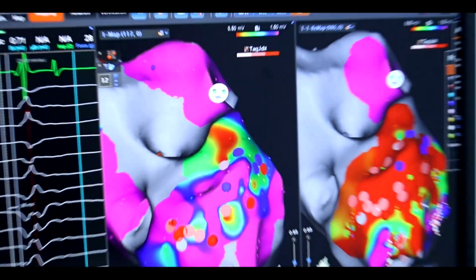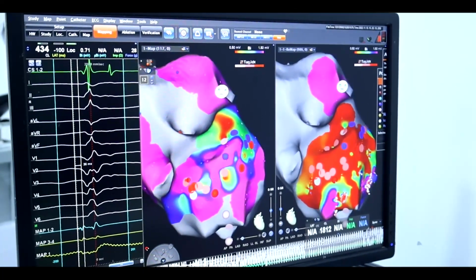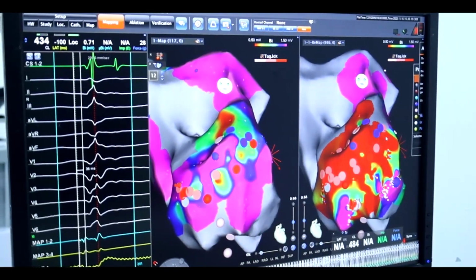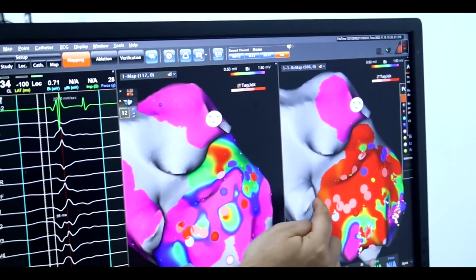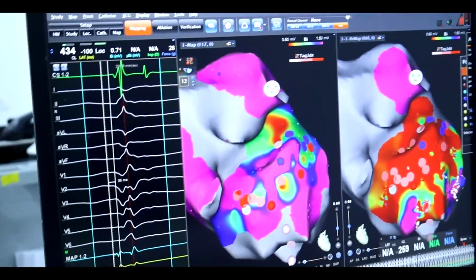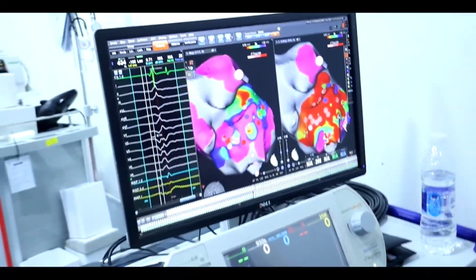and we perform a new voltage map. This is the new voltage map. Prof, this is the scar. When we ablate here, immediately this becomes scar, meaning at the exit point, the filaments are closing through all this.